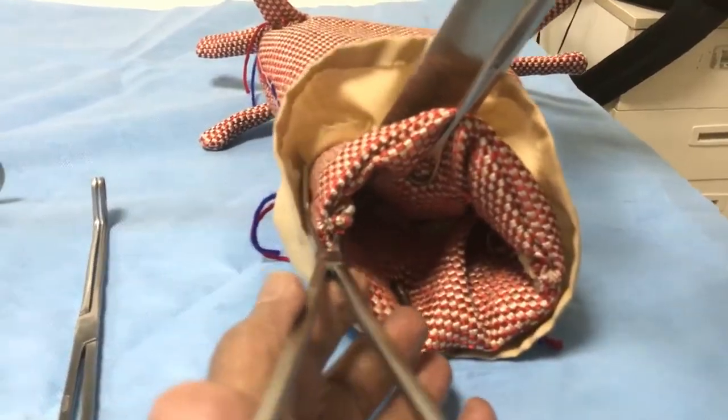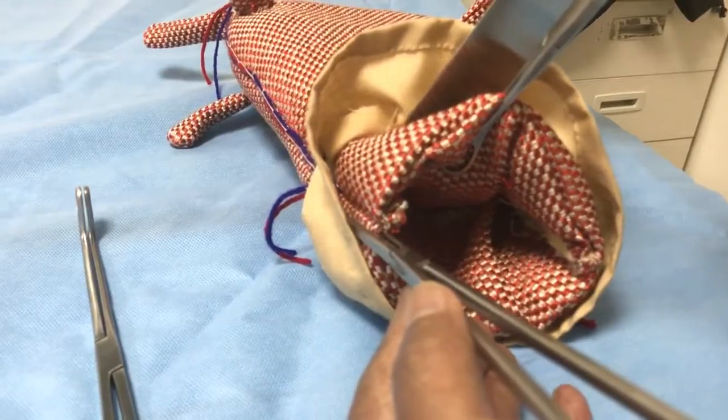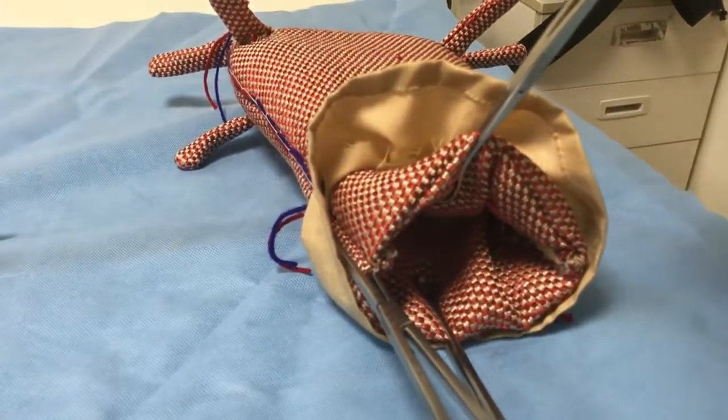At that point, deliberately push up a little more and then clamp it. This will help catch the uterine artery where it joins the side of the uterus.